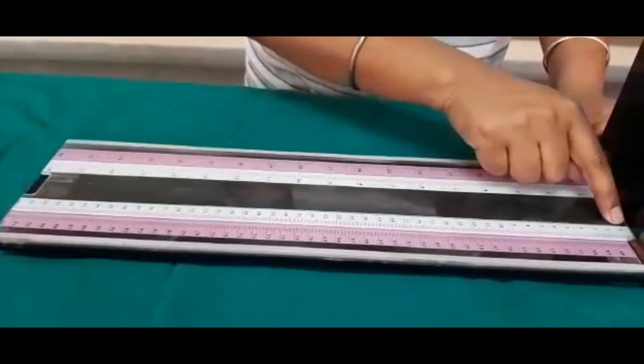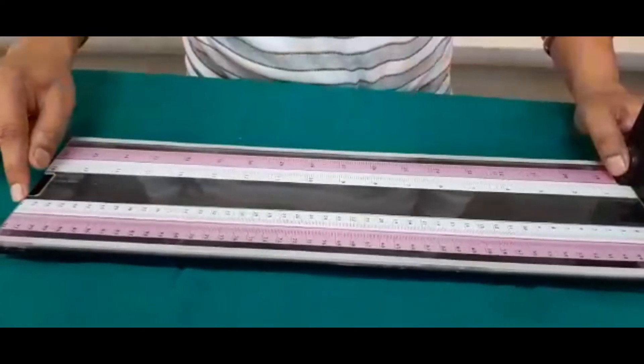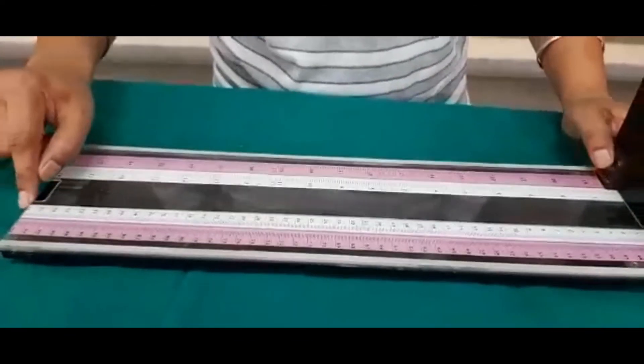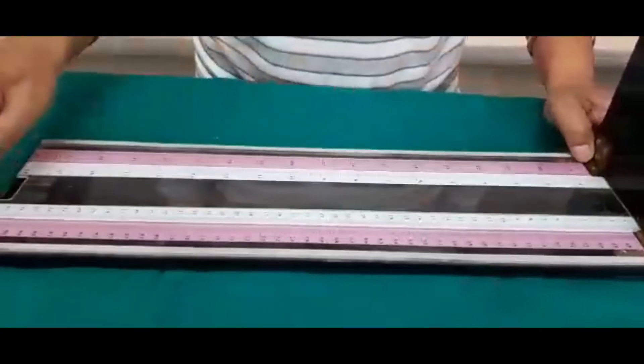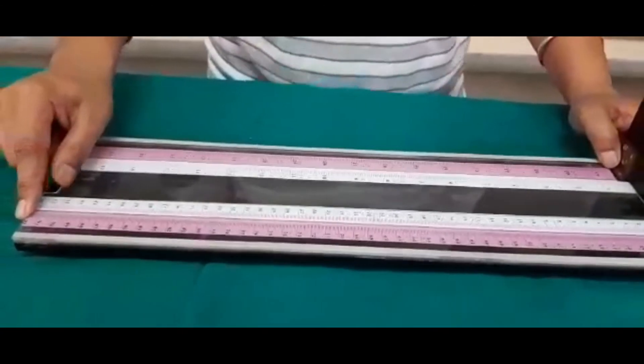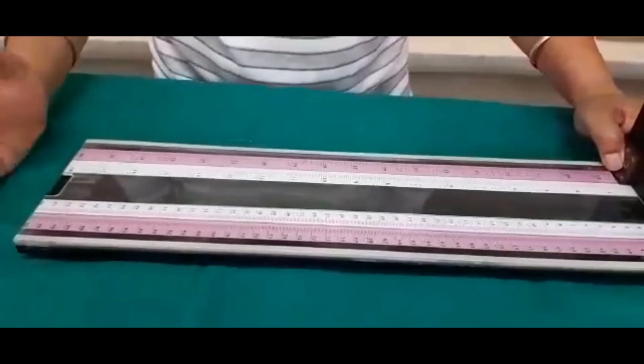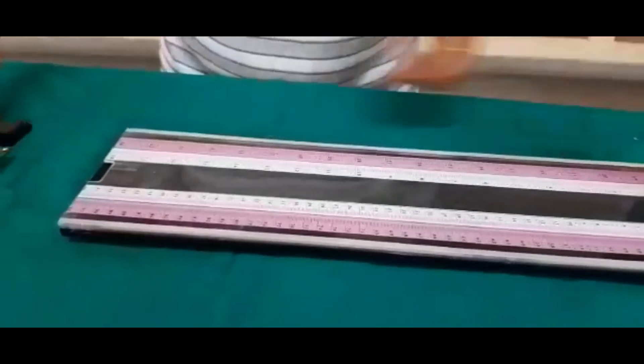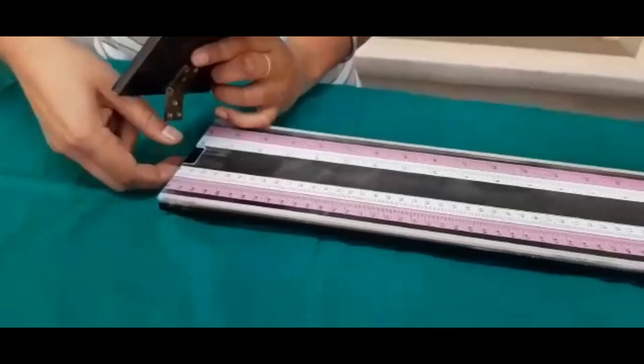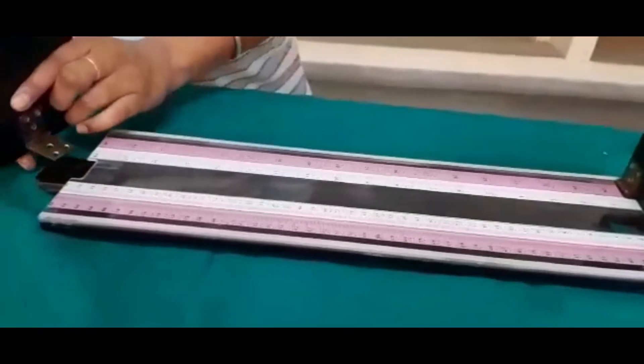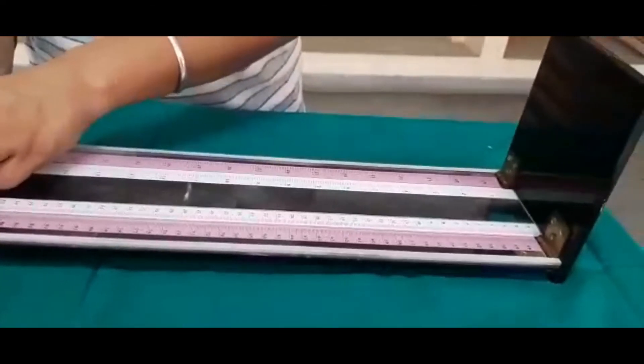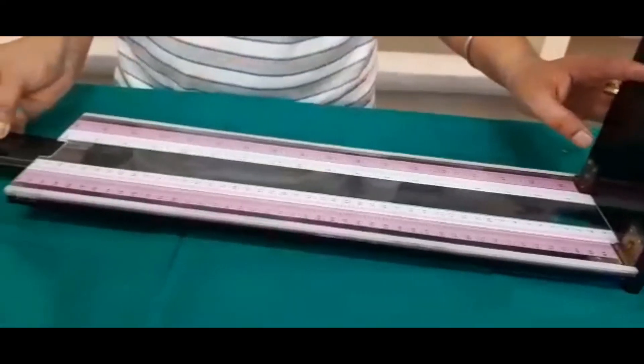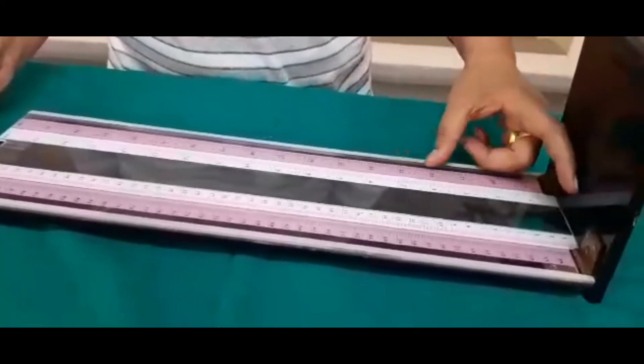White starts from 1 to 46, and after 46, the pink line starts from 47 to 92. And our baby length is till here. And this is a scale. Here, this point helps us.